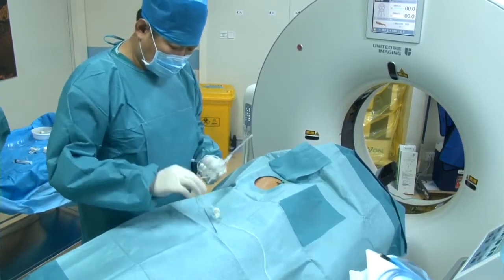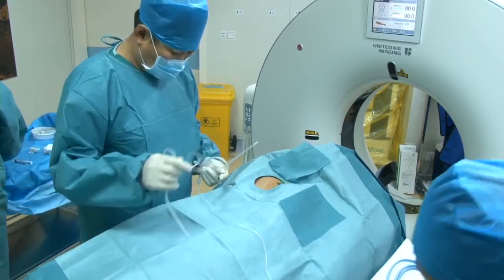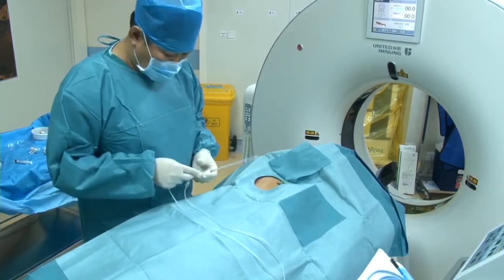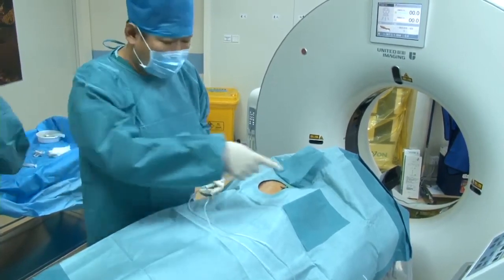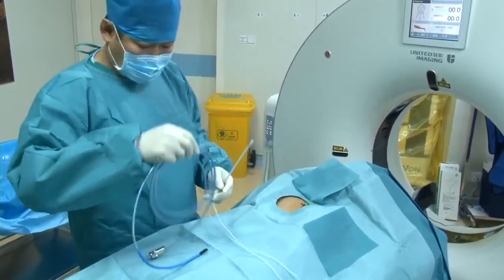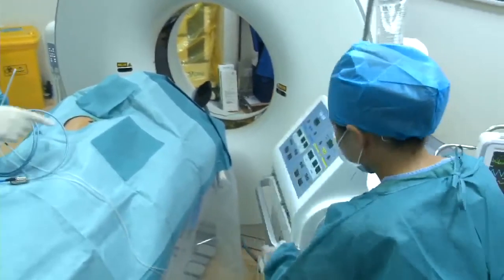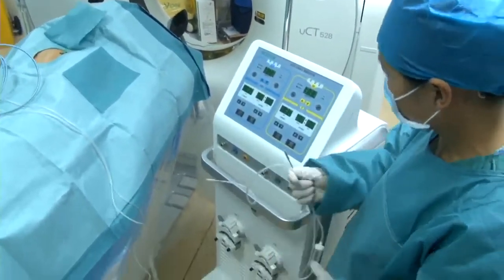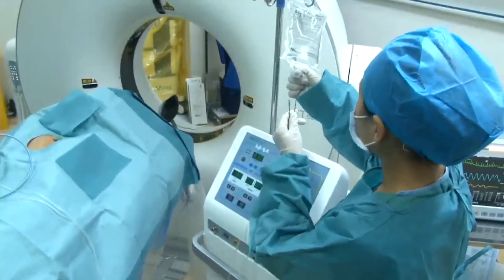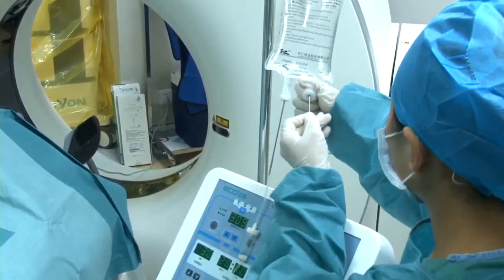So this is upper direction, up, and down. This is down, lower. So we can see the lesion just occupied 1, 2, 3, 4 slices, and the slice of this scan is 2.5 millimeter.